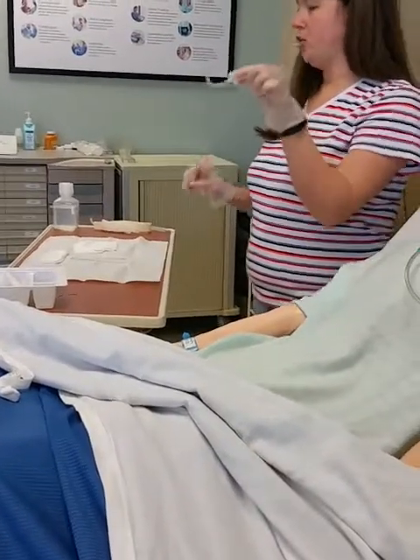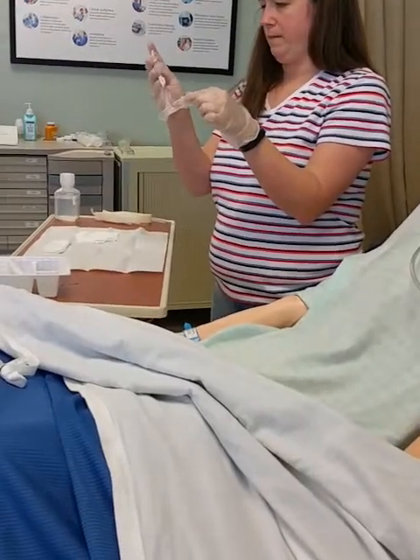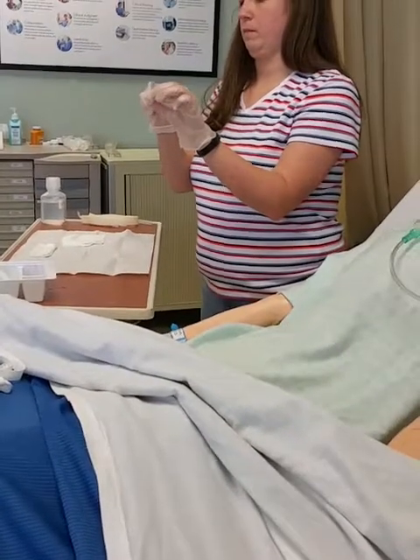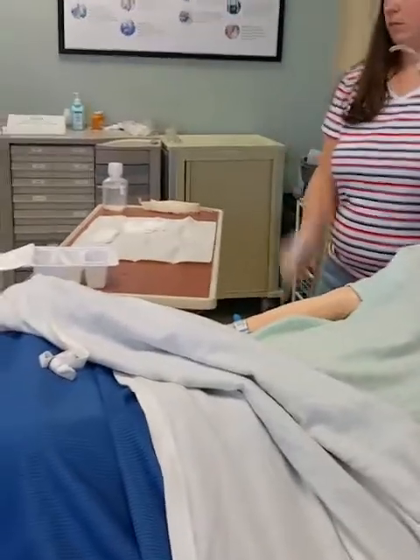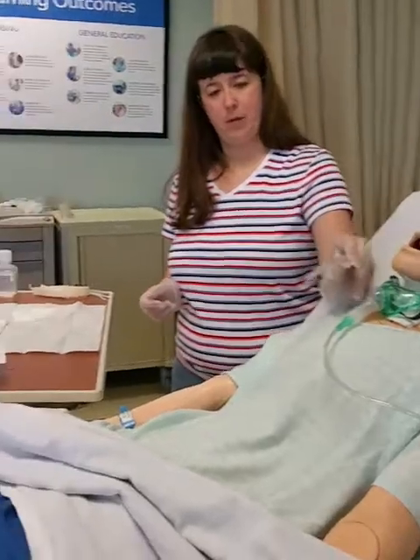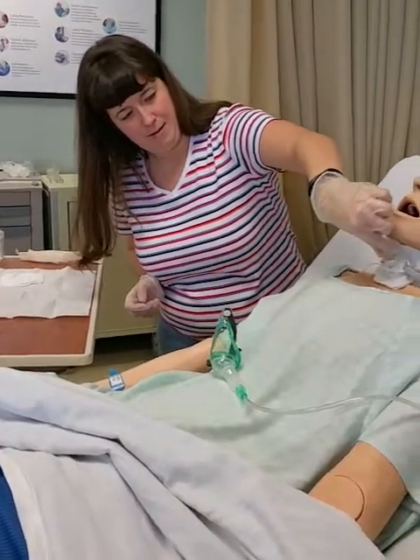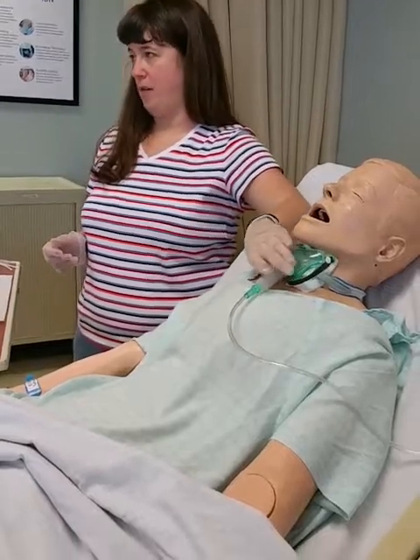Okay. Then I need to dry the inside. So I'm going to grab my pipe cleaners, feed them in. Back and forth, dry the inside, throw them in the garbage. Okay, everything's ready. Put this back in. Make sure it clips. And now I no longer have to be sterile.